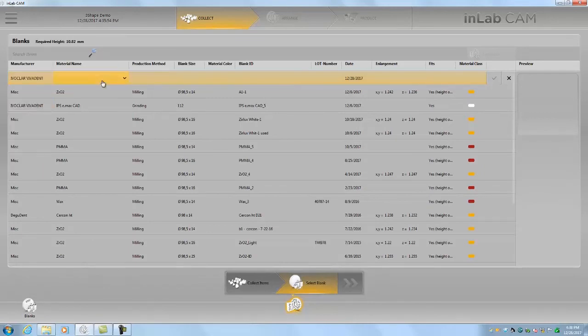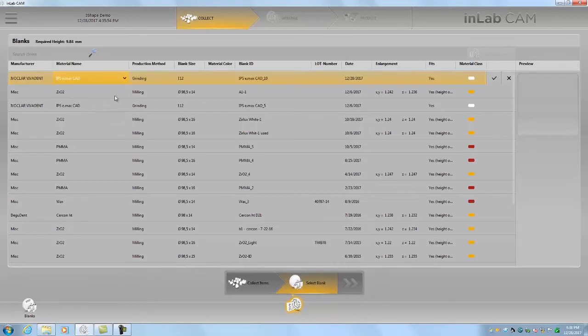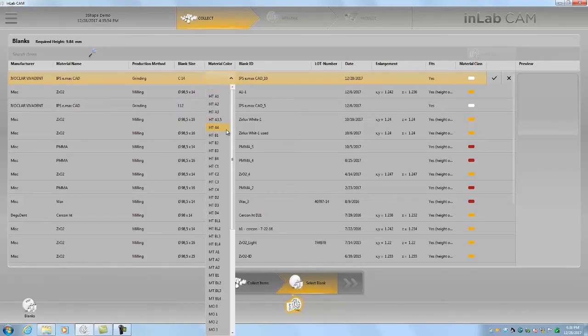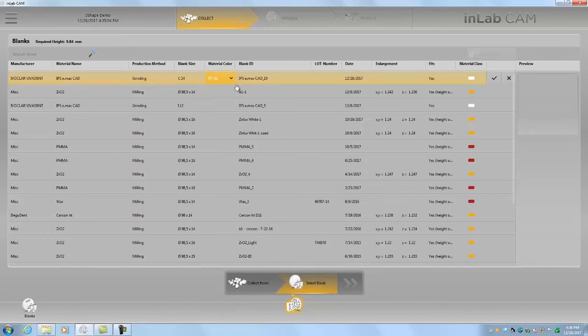Material name Emacs CAD. Grinding. Blank size, we're going to do a C14. Material color, I don't have a block in front of me, we'll say it's HTB2. And we could put in a lot number if we wanted to or enlargement but that's not a factor here.